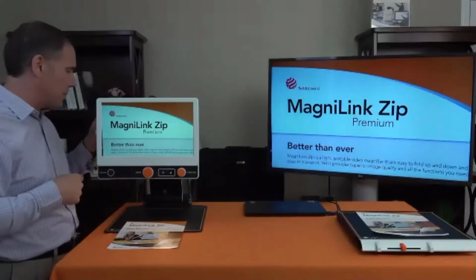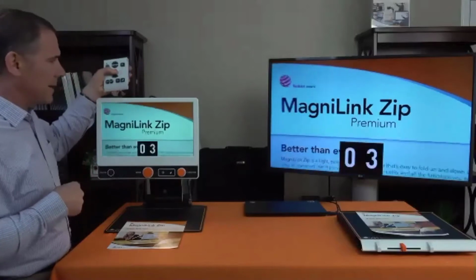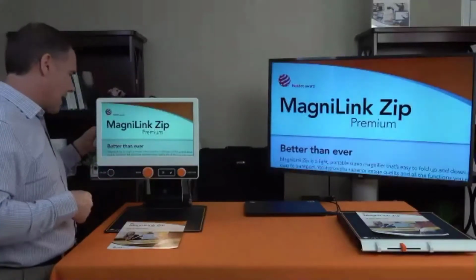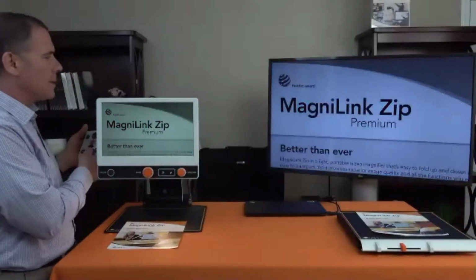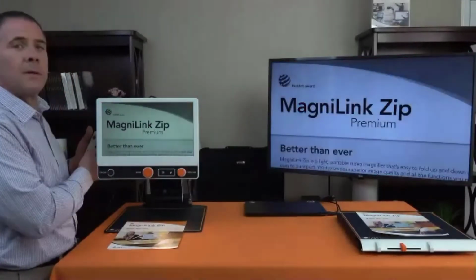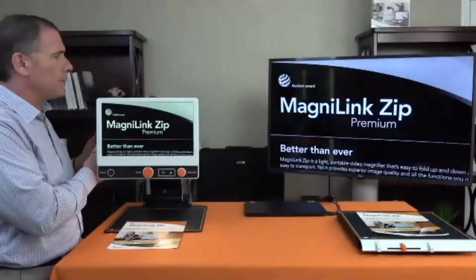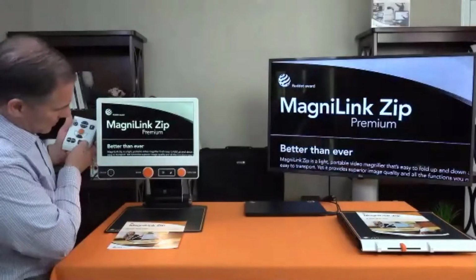So I'll show you. I can advance magnification or decrease it. Same with the knob. I'm going to then change some of the modes. I'm sorry, I went to grayscale, and now I'm going back to color. There, I'm now switching through my high contrast modes.